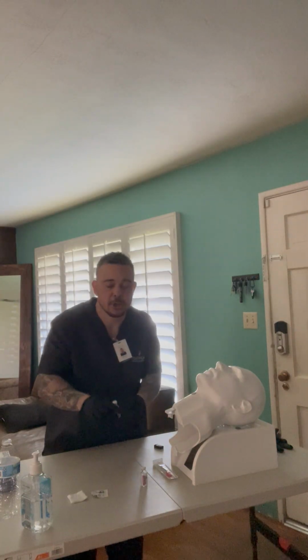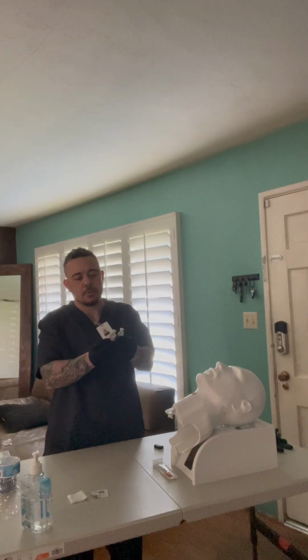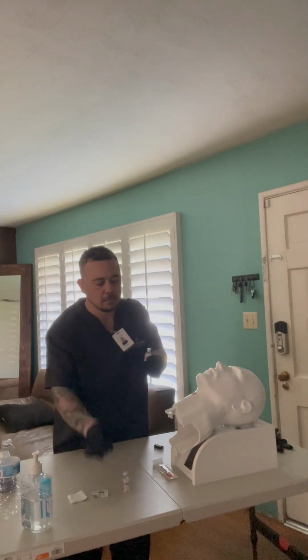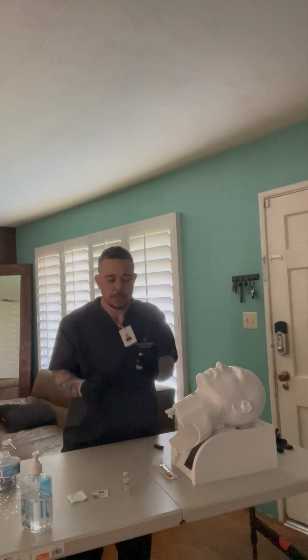First thing I want to do is look at the insulin and make sure that both of the bottles are not expired, so I'm going to look at the expiration date, and it looks like the expiration date is okay. Also, the regular insulin is going to be clear, and the NPH is actually going to be a little cloudy, which you can see here.